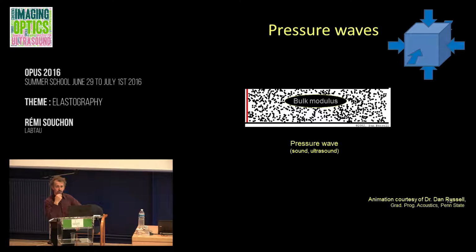Let's first talk about the difference between OCT and the technique shown previously. OCT can look down at depth, whereas the previous technique with its two cameras inside could only look at the surface, with the advantage of having a very simple device. Now, in the case of ultrasound, close to the case of OCT, we'll be looking inside the matter, and to look inside, we will be sending waves to probe the properties of the matter.